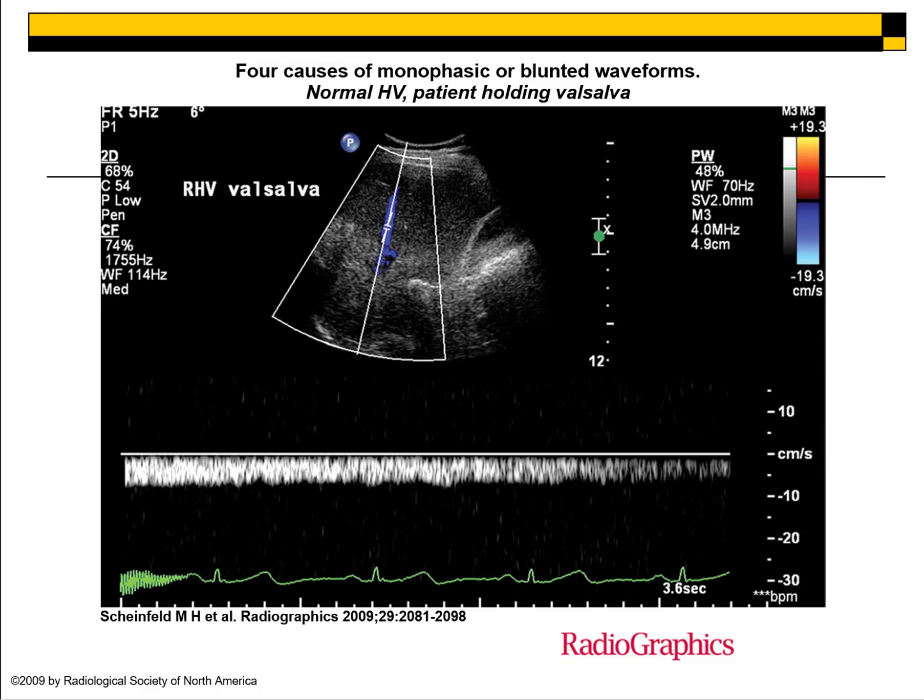Again, just to review, another example of when we do not want our patients to Valsalva. So you need to be very careful when you're instructing them to do whole breaths or anything during our liver Dopplers. Again, if you can, try to obtain this waveform with very shallow or quiet breathing, or have them take a small little breath in and hold it. We don't want them to bear down. As you can see, that would give us an abnormal looking waveform. We already had an example in our previous lecture, in this article: it's the same healthy patient, and then they had them breathe with quiet respirations, and we had the complete return back to a normal triphasic hepatic vein waveform. So do not have them Valsalva.